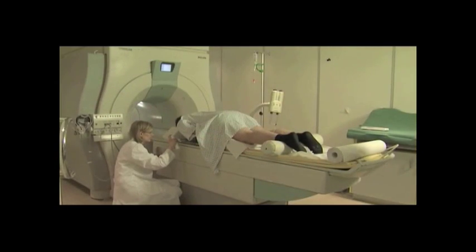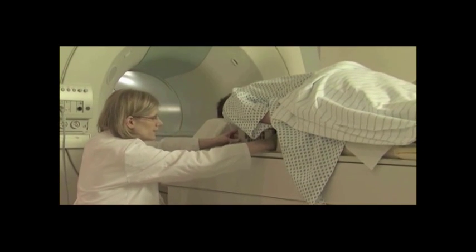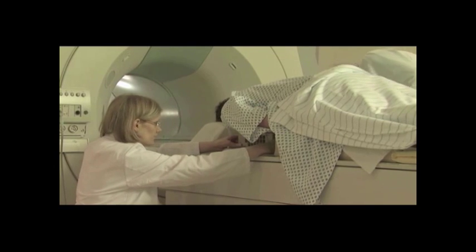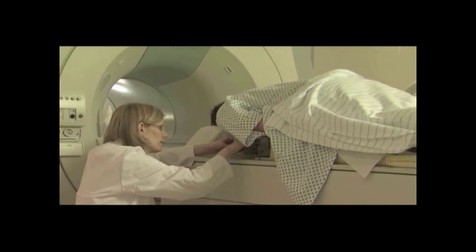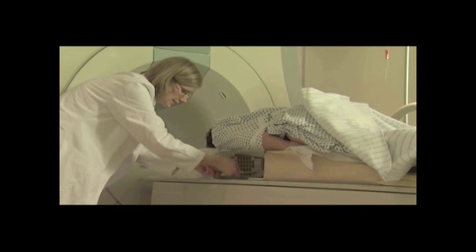Clean the patient's breast and position in the breast coil with enough compression to immobilize the breast. Be sure the breast tissue protrudes through the immobilization plate. The skin surface should be taut in the grid space and clearly protruding.